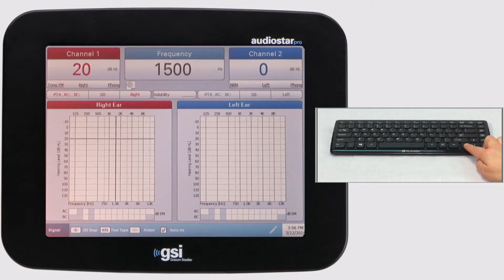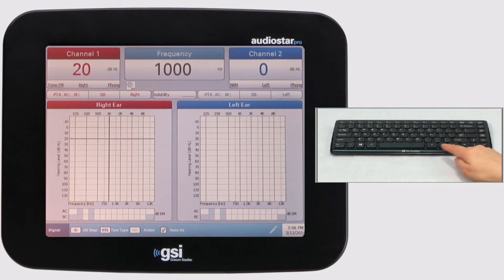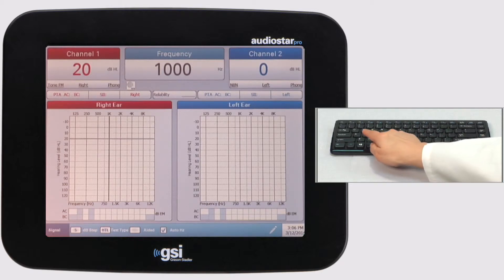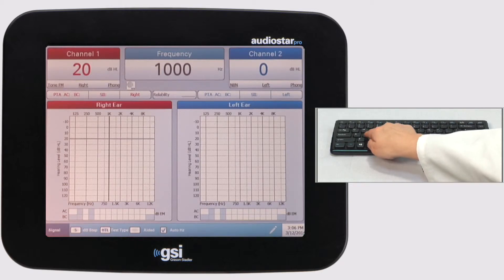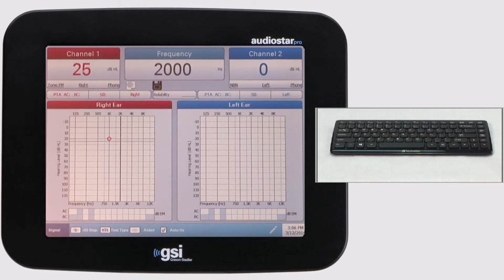As you can see, the arrow keys allow you to change frequency and intensity. The S key stores a threshold. This means the entire evaluation can be completed with only the keyboard, allowing for complete flexibility when testing a young child.